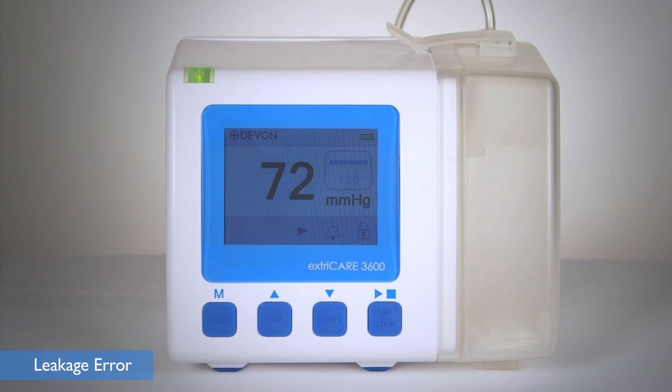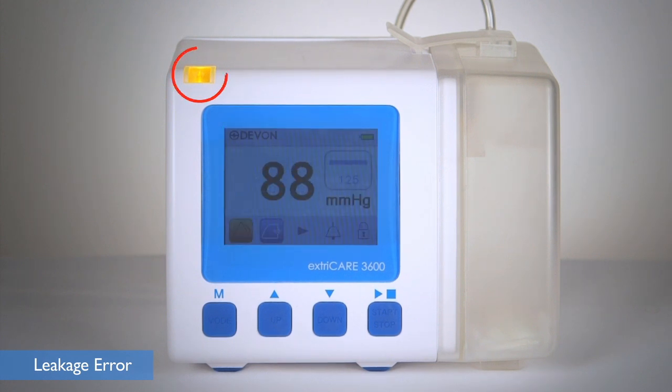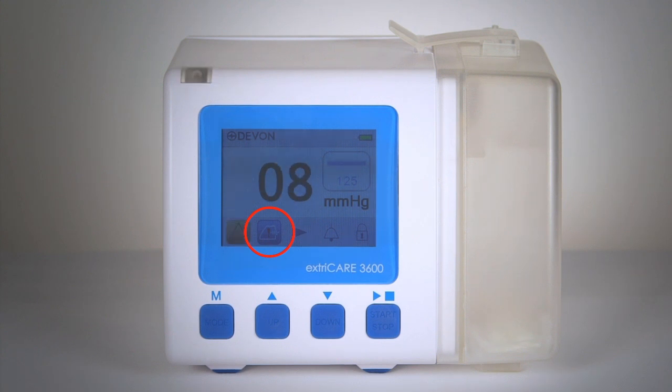The leakage error alarm will sound if the pump is unable to reach 80% of the preset pressure after 5 minutes. The yellow LED will stay on constantly and the minor leakage error symbol will appear on screen. The pump will stay on. If the pump is unable to reach 50% of the preset pressure after 2 minutes of effort, the alarm will sound, the yellow LED will flash, and the major leakage error symbol will appear on screen. The pump will remain on, but will power off after 10 minutes of continuous alarm.